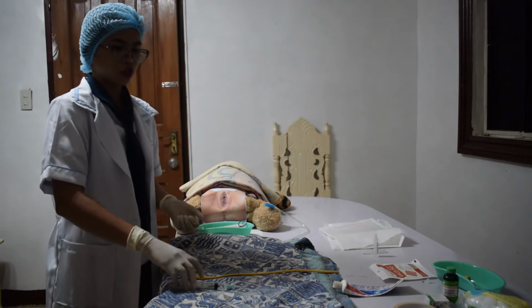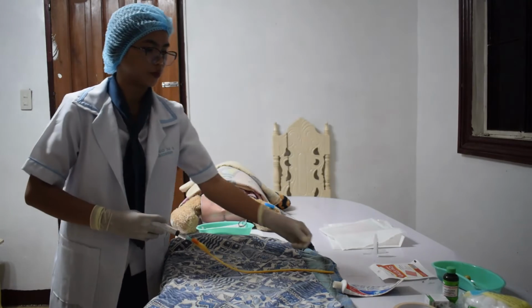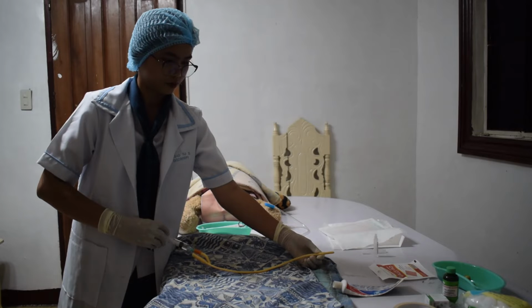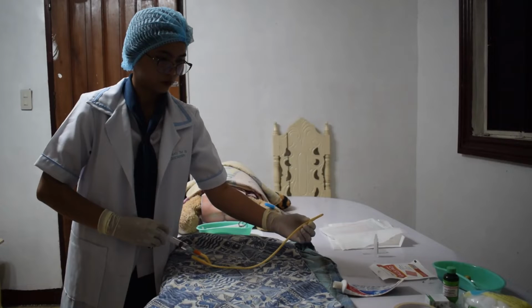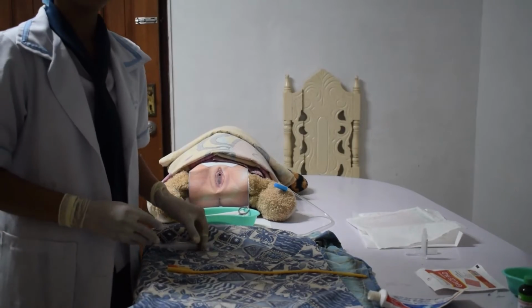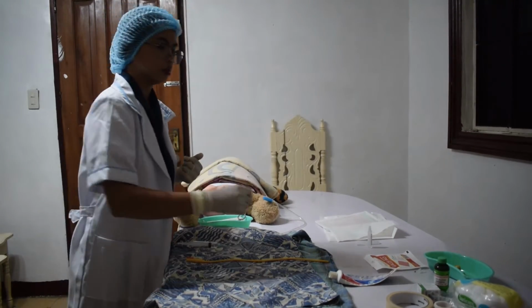Attach the prefilled syringe to the indwelling catheter inflation valve. Test the balloon; if the balloon does not fully inflate, replace the catheter. Next, lubricate the catheter 1 to 2 inches for females and place it with the drainage inside the collection container.